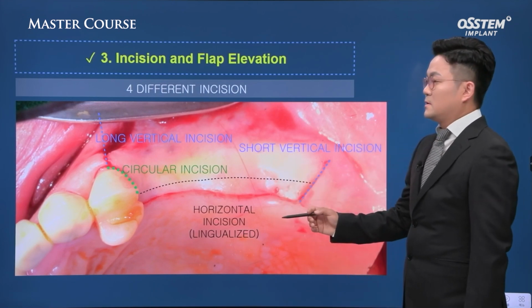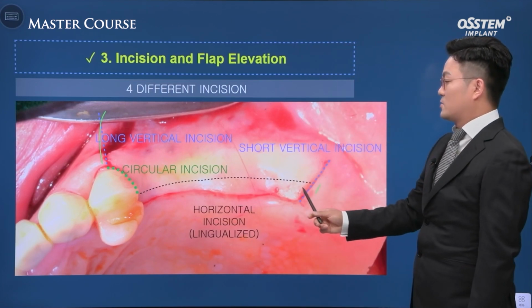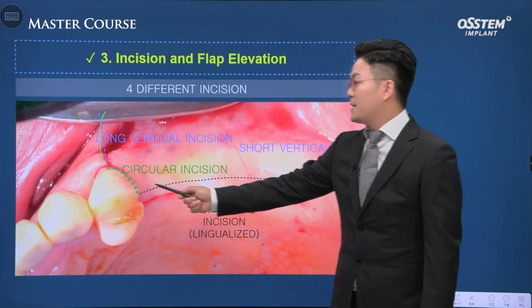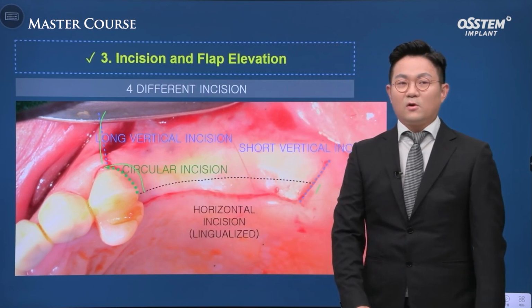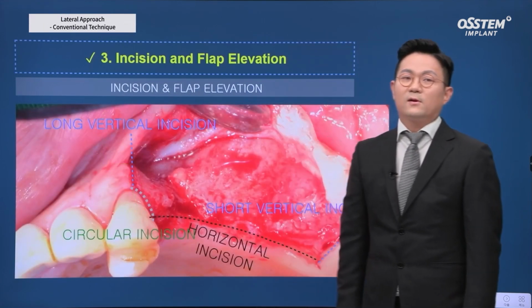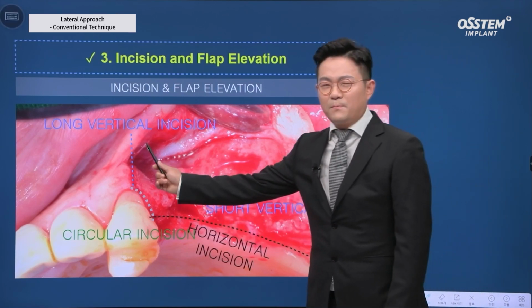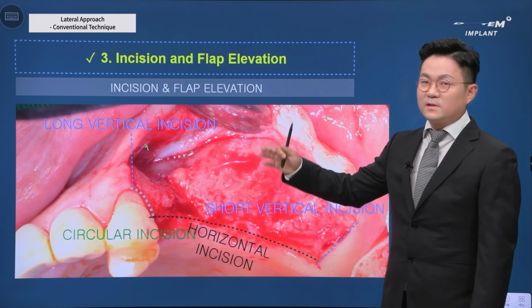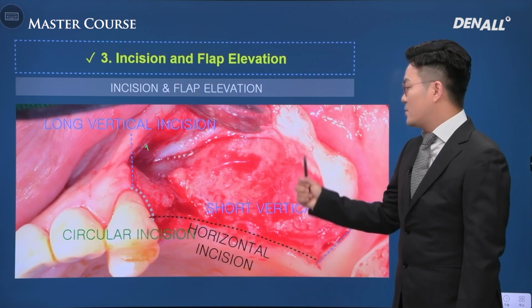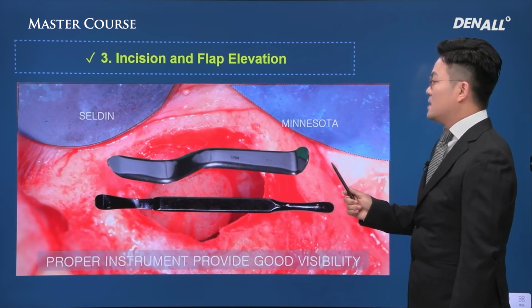So again, on the front side make a long incision and a shorter one on the distal side, with the horizontal incision leaning to the palatal side, and a clean incision is a must, so that there will be no flap tear, but a clean detachment. Then you will open the flap like this. The depth of the incision compared to the flap will be wider, so it would open more to the upper side, so that sufficient access is secured.